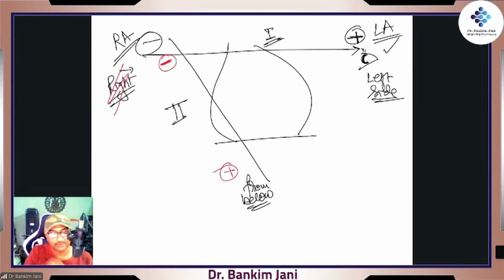So lead 1 is from the left side, absolutely watching from the side. In lead 2, the signal going towards below, this particular electrode, is just recorded. So it will watch the lower part, the base of the heart, as if watching from there.